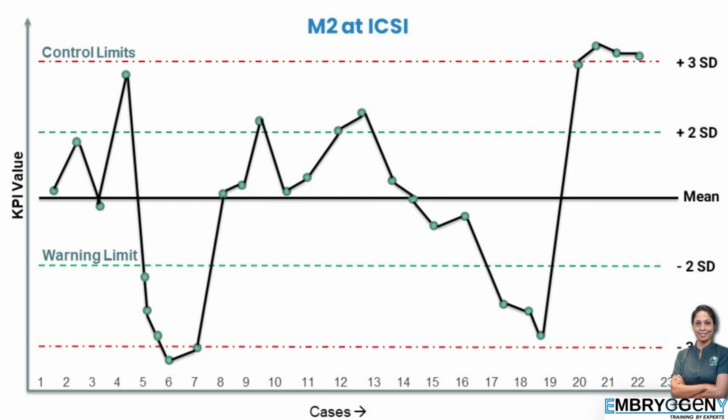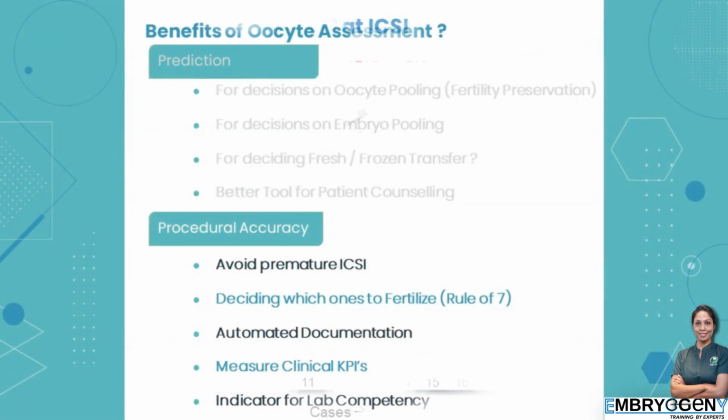Getting many GVs and M1s after OPU may at times be a few one-off cases. However, if your IVF lab is consistently getting a low number of mature oocytes at ICSI, then it does reflect that the IVF stimulation is not optimal. It could be either a clinician new to IVF stimulation, or a batch of gonadotropin, or the trigger dose batch or type. So the oocyte competency report will help to objectify the problem and present trends in KPI.